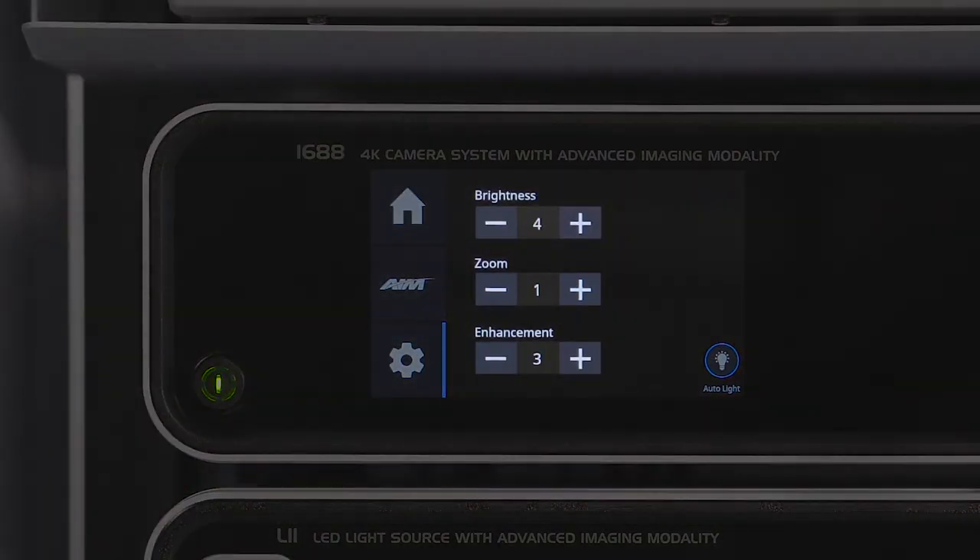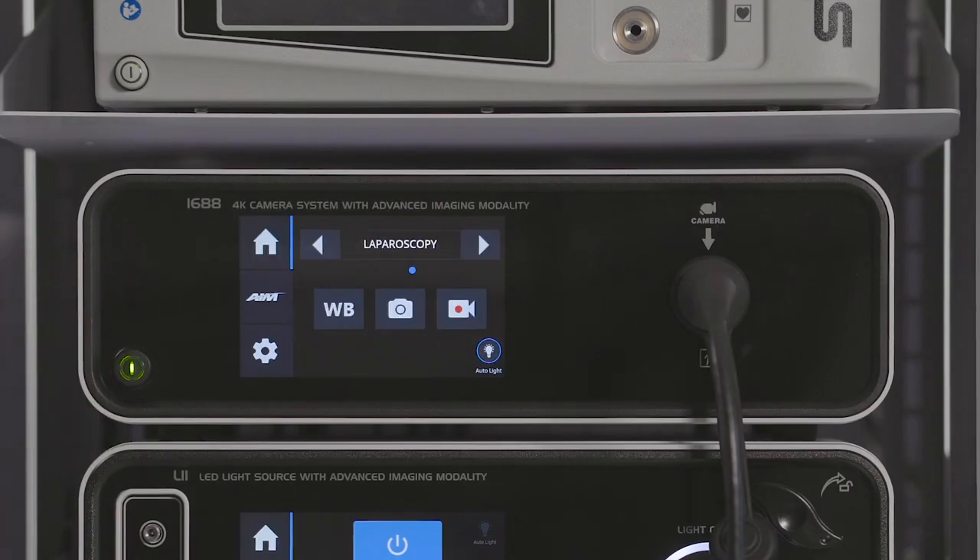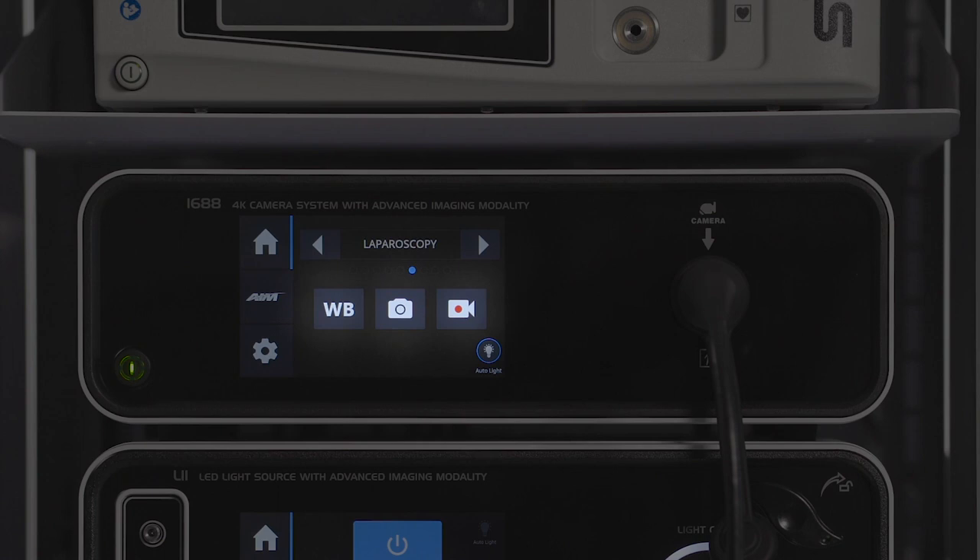Press the settings icon to navigate to camera settings. Here you can adjust image brightness, zoom, and enhancement. White balance, image capture, and video recording are functions that can be performed from either the camera head or the camera control unit.